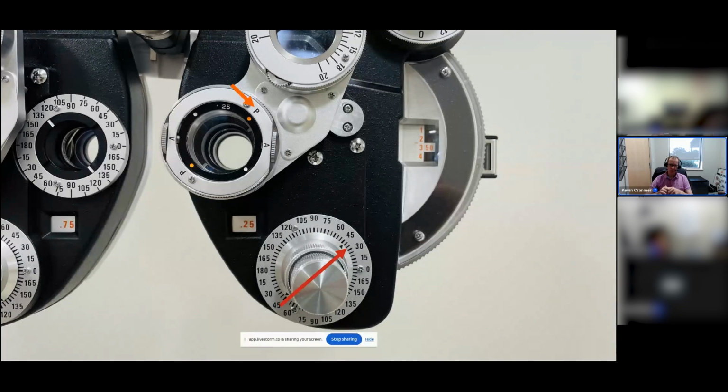So again, a bit confusing, but basically you're determining if the patient wants more minus cylinder power or more plus cylinder power, and then you rotate that knob accordingly. If you're on a plus cylinder phoropter, then it's going to be the opposite. If they select the white dots, then you're going to add more cylinder power because it's the plus cylinder phoropter.